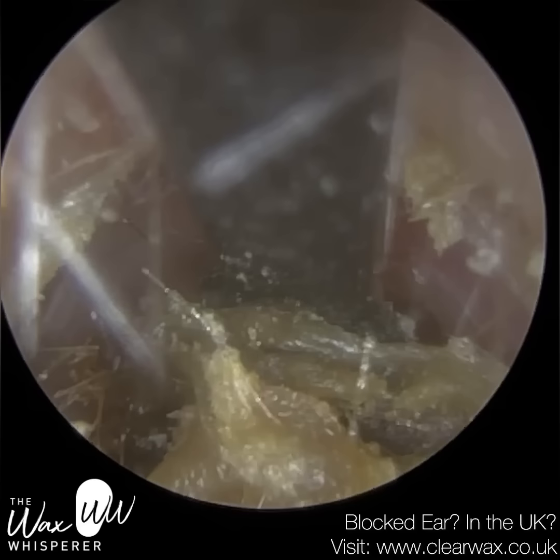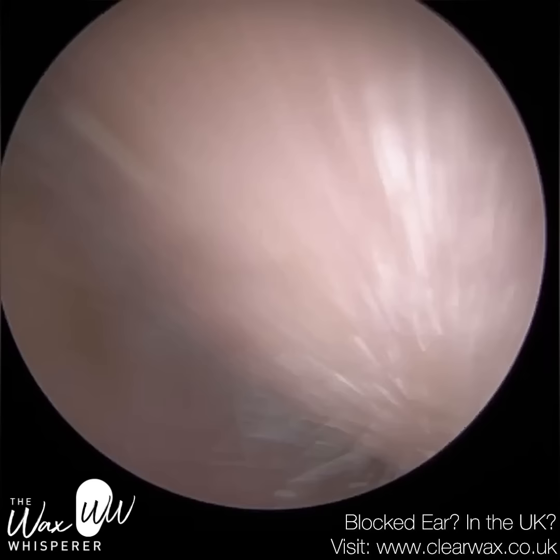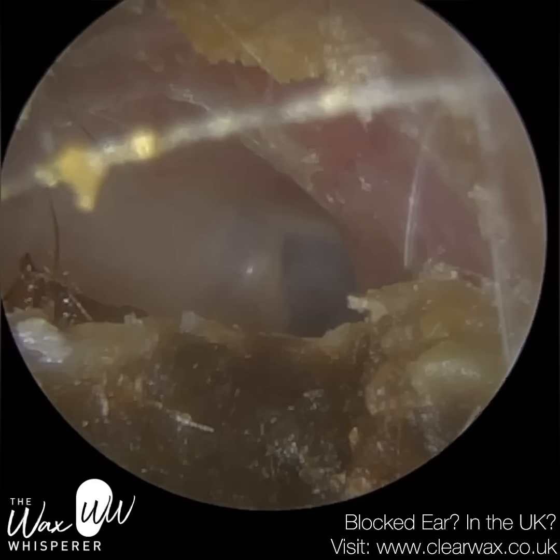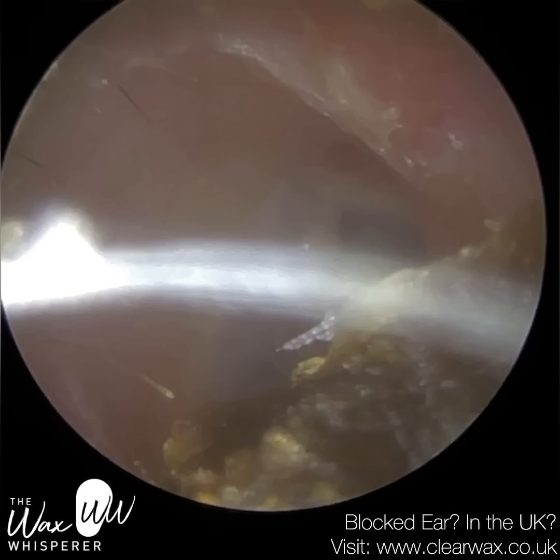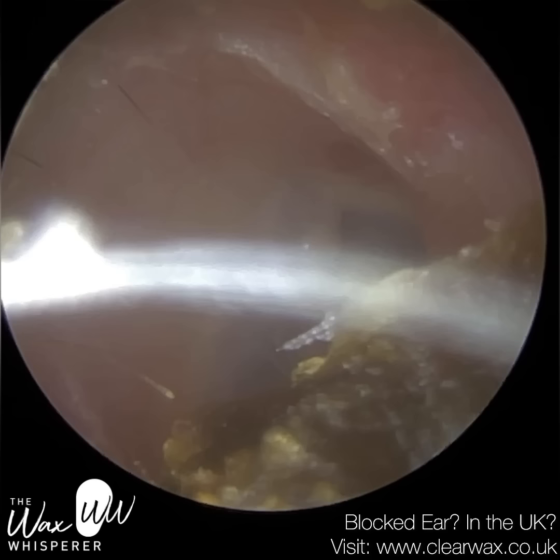And thirdly, the instrument itself has a curvature that mimics the curvature of the ear canal. That means there's less friction and less painful contact against the canal wall. If the geometry of the instrument resembles the geometry of the ear canal as you're gliding it, there's going to be less resistance and friction, making it more comfortable for the patient.